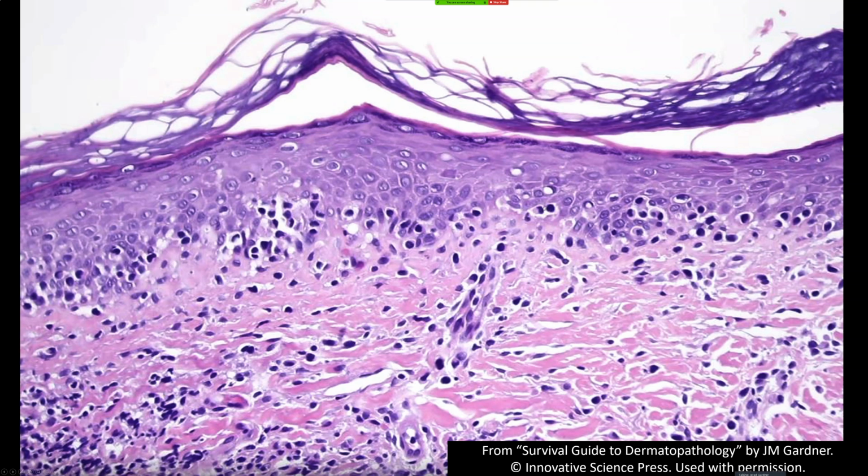Sometimes I feel that mycosis fungoides has relatively small, bland lymphocytes. And if you find it difficult to evaluate lymphocyte atypia, you're in good company, because unless they're super ugly, I find it really challenging personally to evaluate the atypia. And if you're looking for cerebriform, crinkled nuclei, man, I promise you, I can find some cerebriform nuclei in any skin. Give me a biopsy with some lymphocytes on it, and I'll find you something that looks cerebriform. So I think it's a skill much beyond my ability personally.